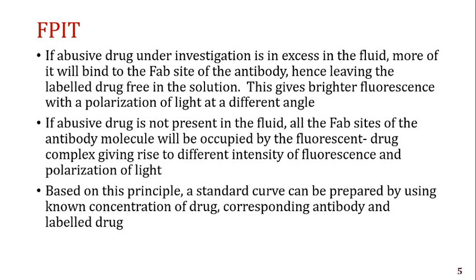If the abusive drug is not present in the fluid, all the FAB sites of the antibody molecule will be occupied by the fluorescent drug complex, giving rise to different intensity of fluorescence, which is less than the fluorescence shown by the drug fluorescent complex, and polarization of light will be at different angle.